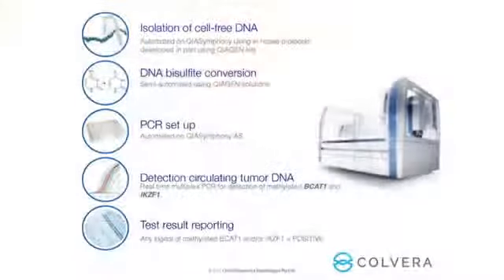How does it work? Well, this is the slide here, and I very thankfully put a big QIAsymphony on the slide. We've worked very closely with QIAGEN over a number of years. The first step involves extracting DNA from a relatively large volume of plasma. In our assay it's 3.9 mL, which is where we wound up because that's effectively what we get from one purple top tube of whole blood. So a very large amount of plasma that we're working with, and that was pretty tricky.